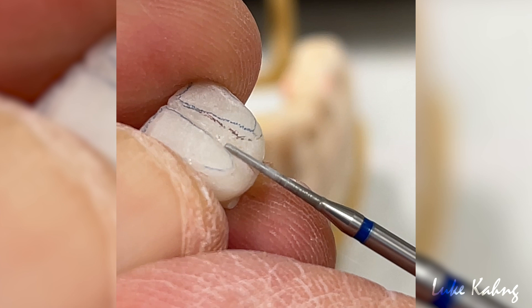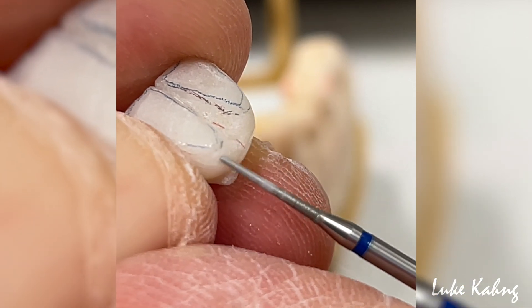Once baked, the zirconia is again contoured before being shaded.